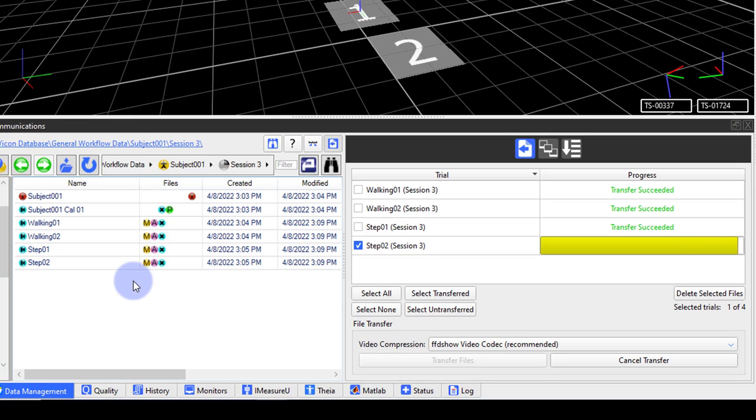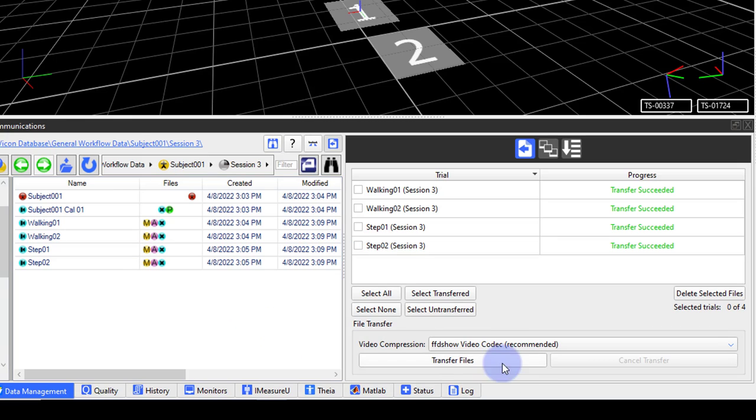Once all the trials have been transferred, it is best to delete the raw video files to free up space on the video drive. Click the select transfer button, then delete selected files.